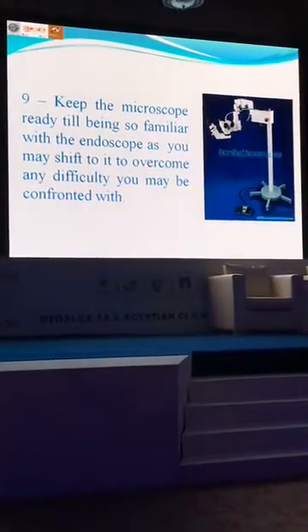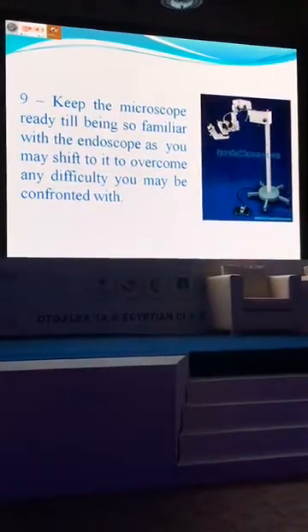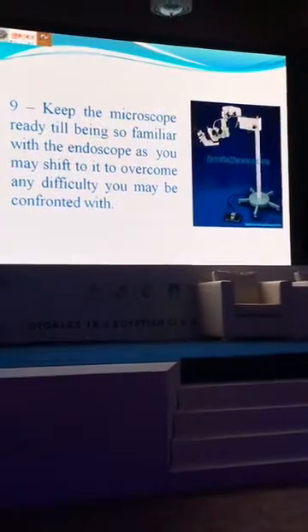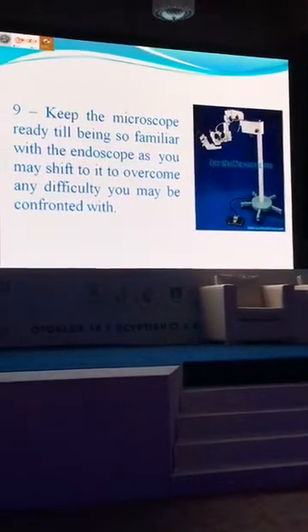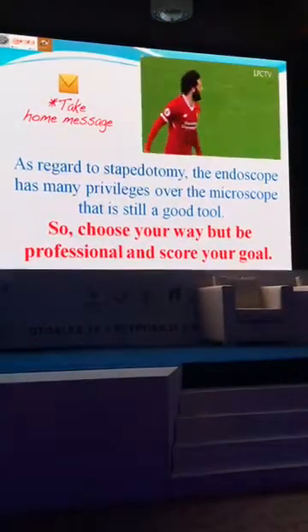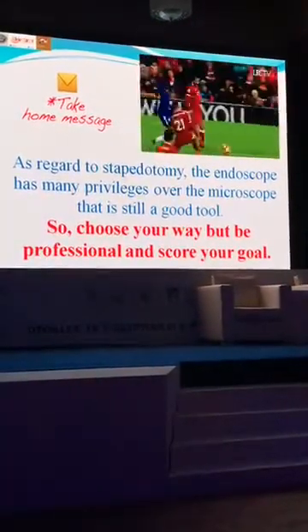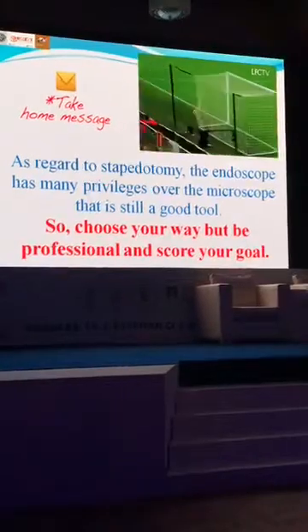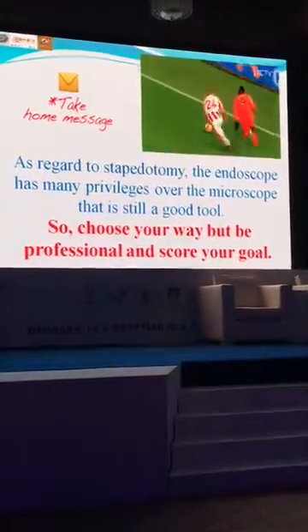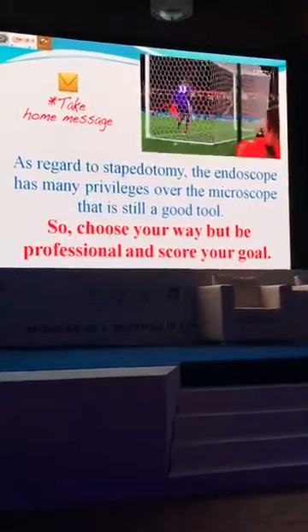Ninth and finally, keep the microscope ready until being so familiar with the endoscope that you may shift to it to overcome any difficulty you may be confronted with. Finally, please take home message. As regards stapedotomy, the endoscope has many privileges over the microscope, that is still a good tool. So choose your way, but be professional and score your goal.